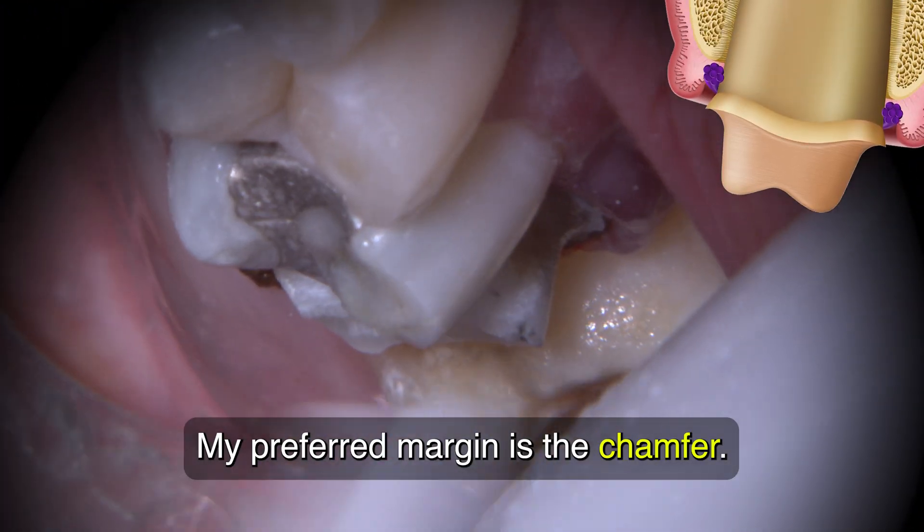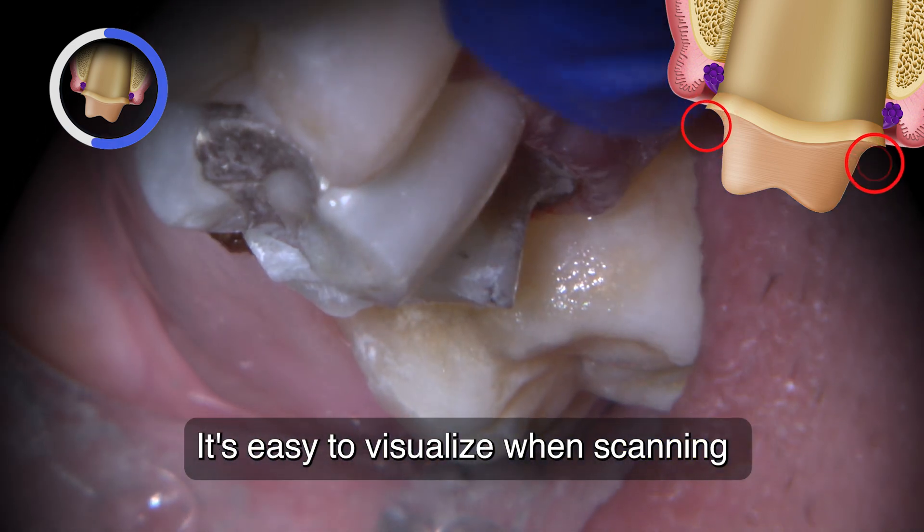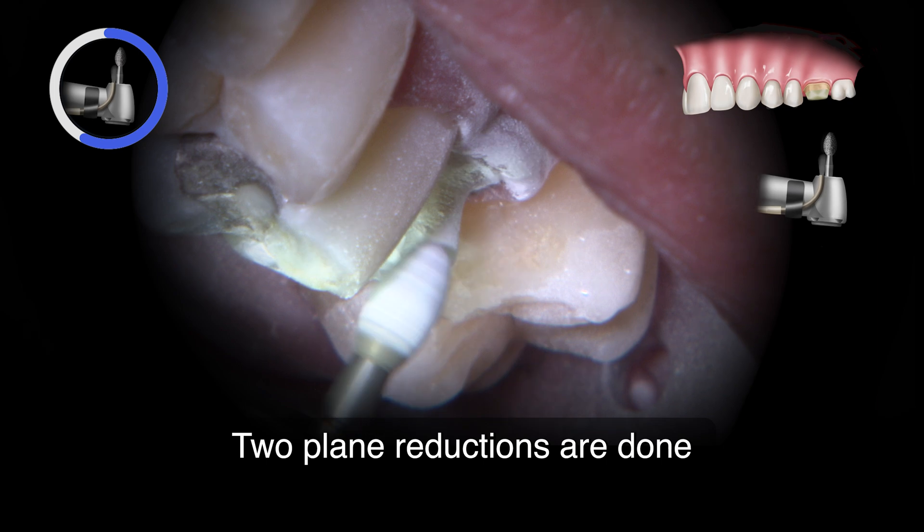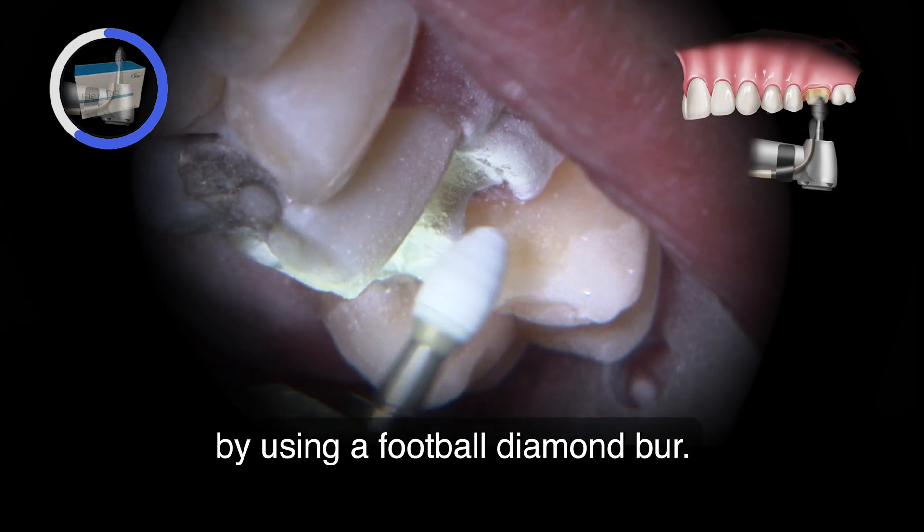My preferred margin is the chamfer. It's easy to visualize when scanning and easy to mark the margin for design. Two-plane reduction is done by using a football diamond burr.